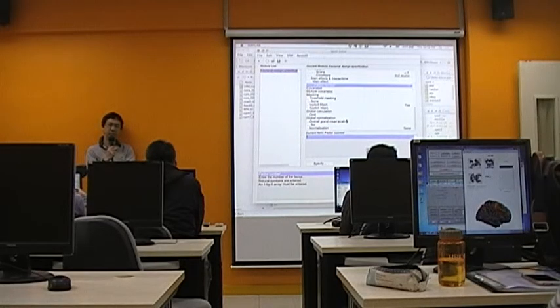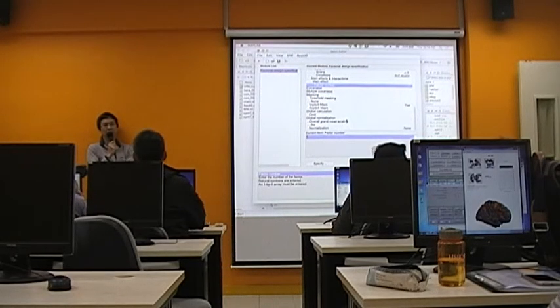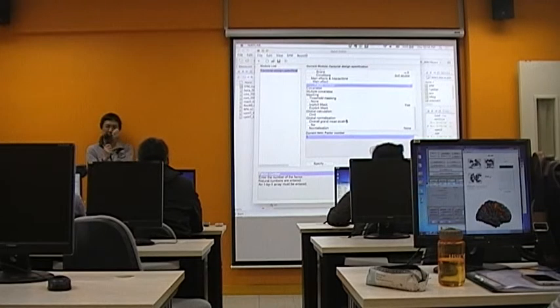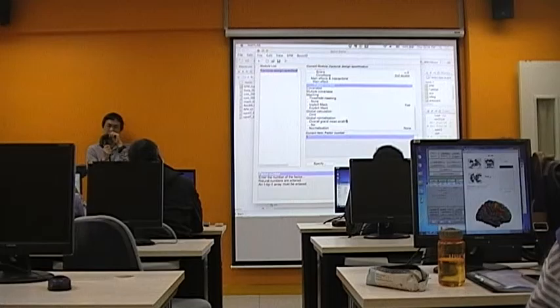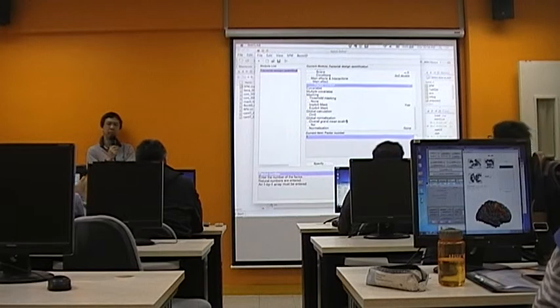So in that case, shall I actually use multivariate pattern analysis? No, I would not recommend that. Okay, then how can I do it? Just like you use the general linear model to see whether there are some differences in this within-subject design.